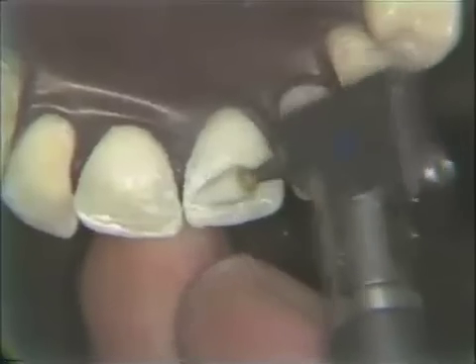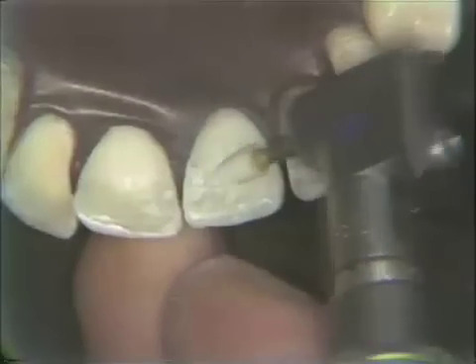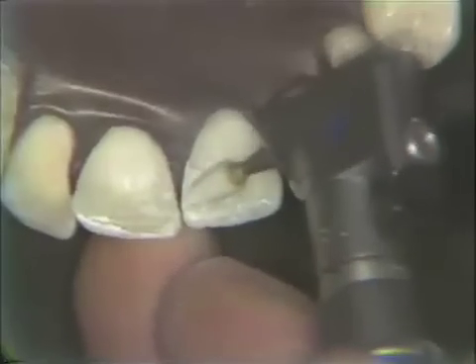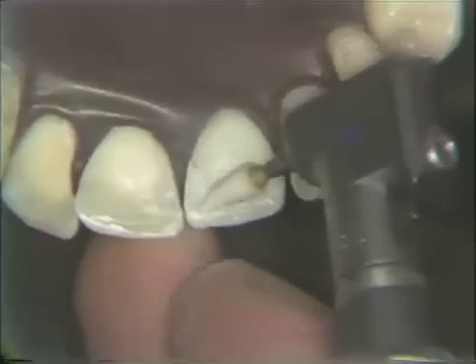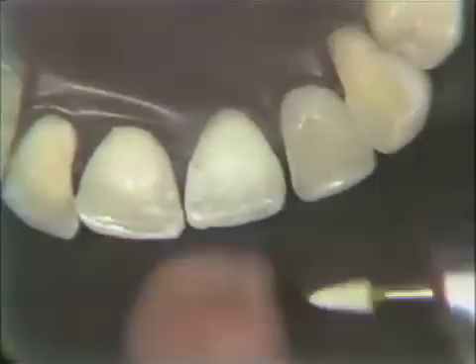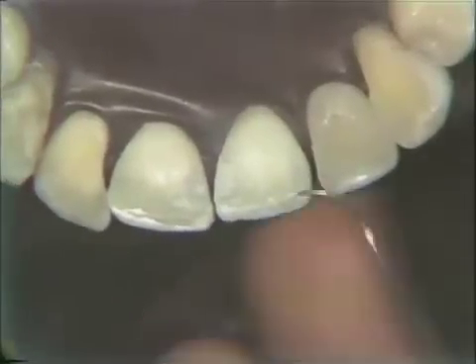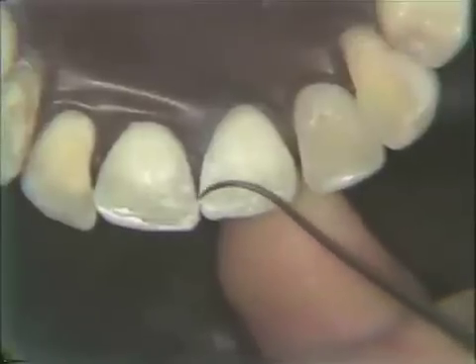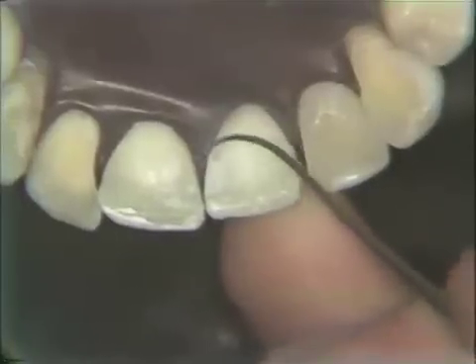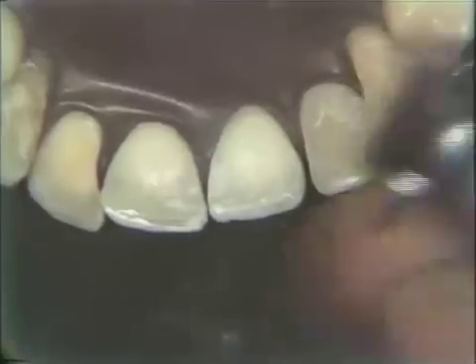But at this point, it's rather a spade-shaped central, so that we were able to get our carrot-shaped stone in on the entire surface, which gives us a very beautiful contour of the tooth itself. Now he's going at the cervical slightly. Check again. Always inspect. Always keep checking. Don't overdo. One of our problems when we're first doing these things is that we have a tendency to overfinish.